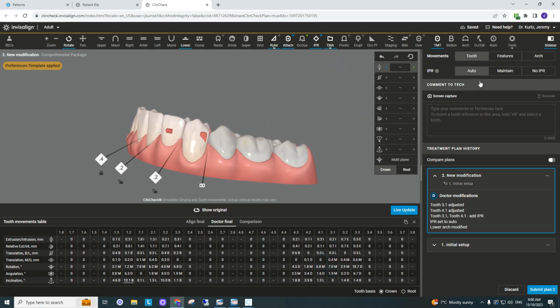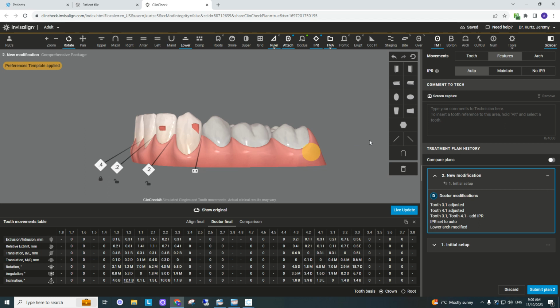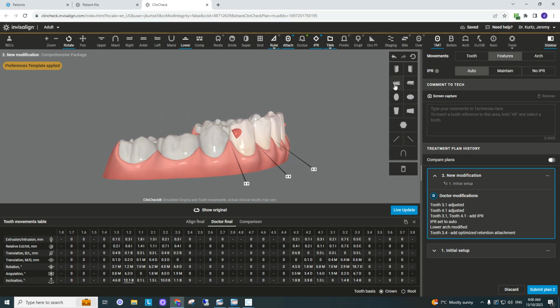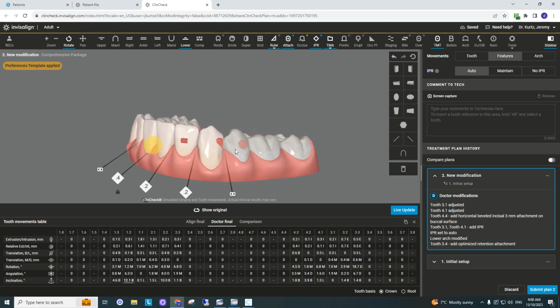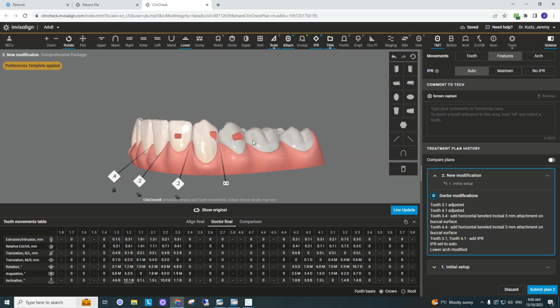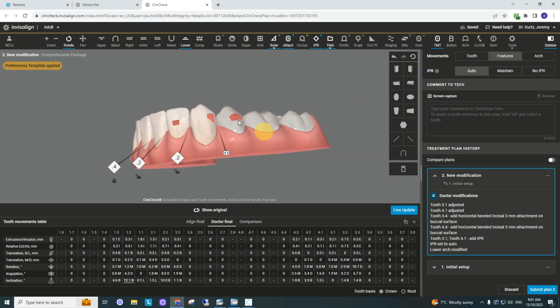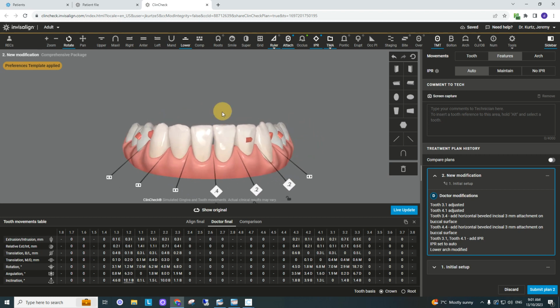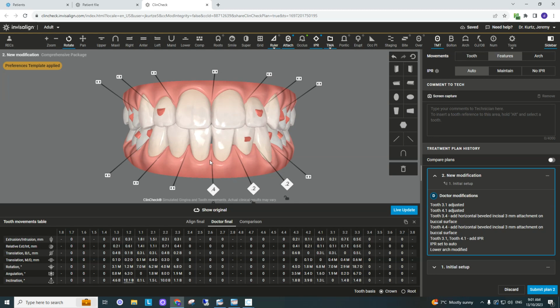And now if I'm adding intrusion, I would want to change my attachments. So I'm going to put an optimized retention attachment. That's one option. Another option is I can put here for intrusion supporting. I don't mind these, so maybe I'll use this one. It's a rectangular attachment, but beveled to make it easier to take it in and out, but it still has the flat surface on the bottom, which will allow support for that anterior movement. So to me, that looks a little bit better.